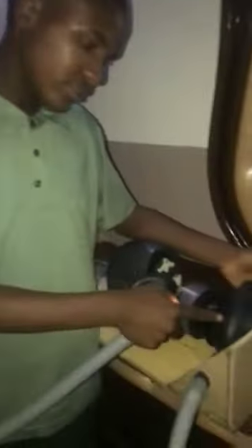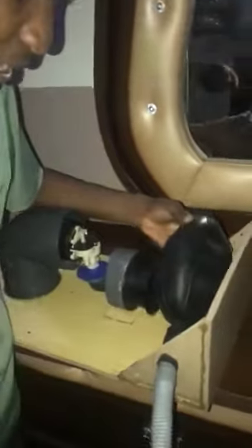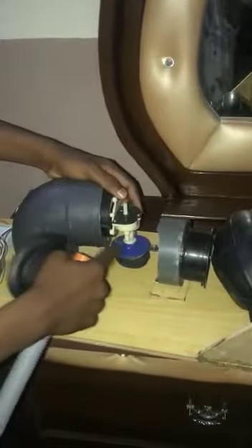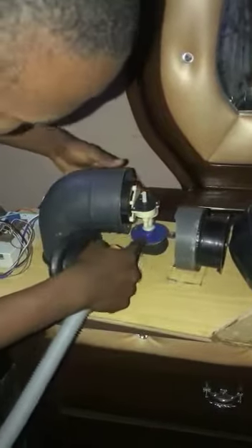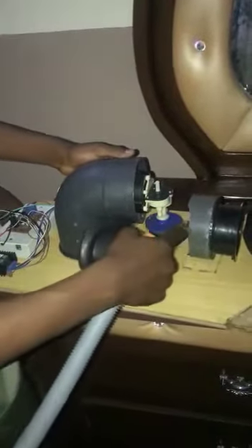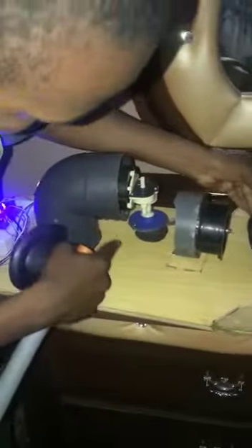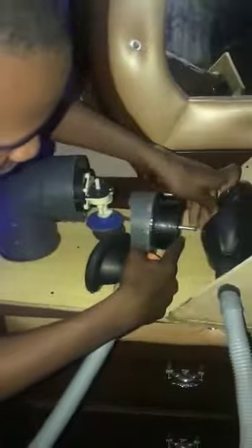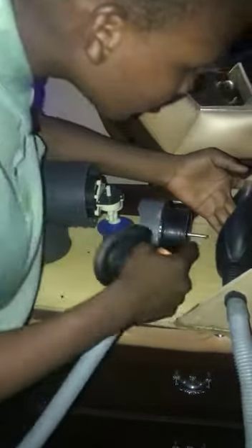This is the newly designed manual ventilator, which pumps air in and out of the lungs of a human. This is the mechanism that compresses the balloon. This is the motor, and these are the gears that convert circular motion into linear motion, as shown below.